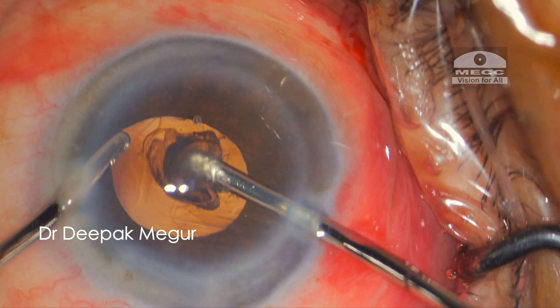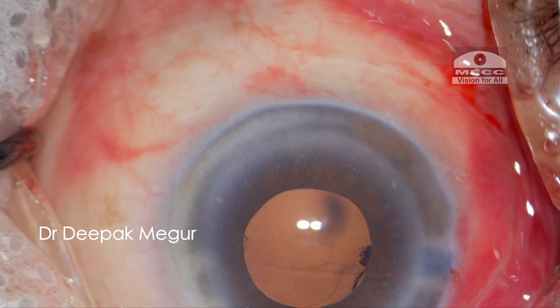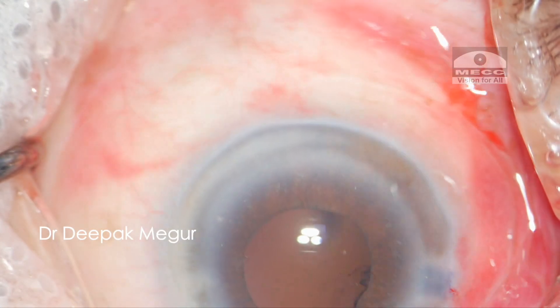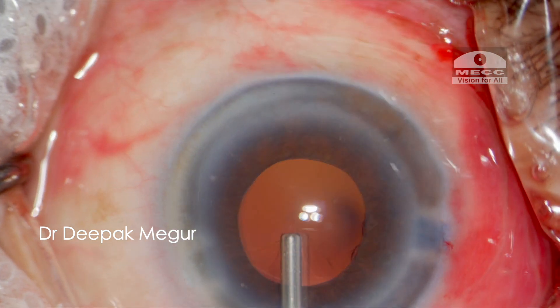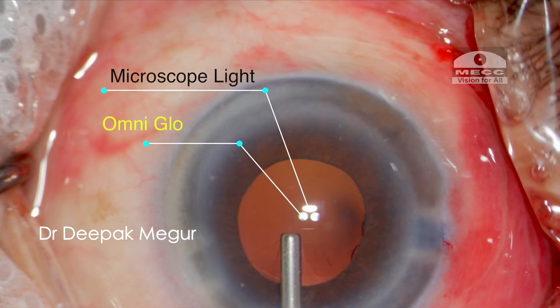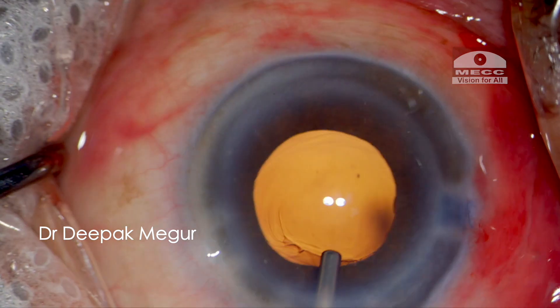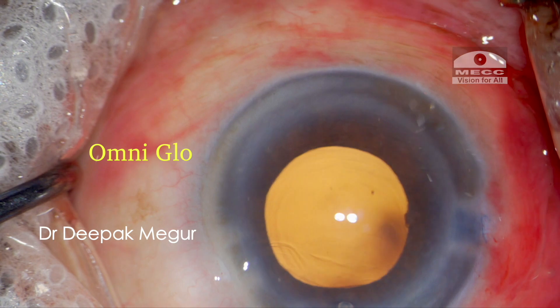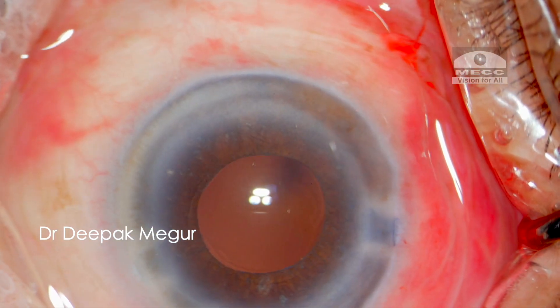Let us see the difference with different combinations of the light sources. This is with the microscope light on, this is the combination of both the microscope light and the Omniglow, and this is with just the Omniglow. This is how it looks when only the microscope light is on.